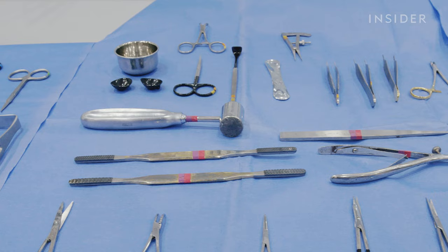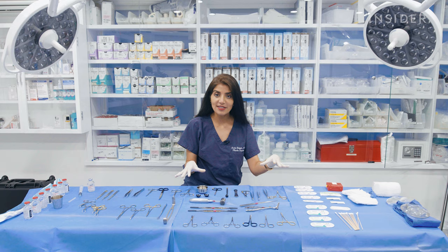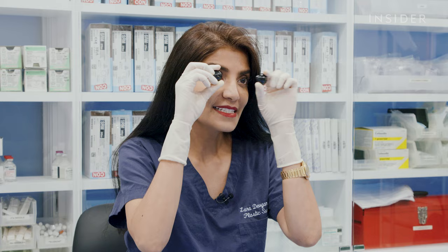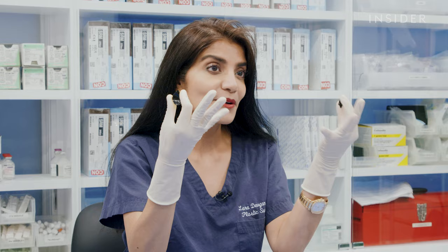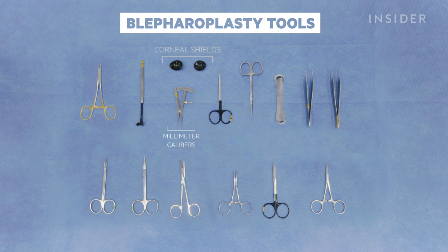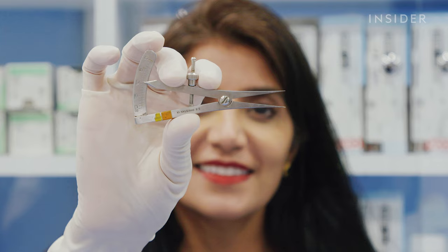These fine and beautiful instruments here in front are some of the instruments that I use for blepharoplasty. First, I use corneal shields to protect someone's eyes so that we don't get corneal scratches or irritation when we're doing the surgery. Next, I use these millimeter calipers to precisely measure the fine details of the operation, because you want to make sure that not only is the lid margin length the same on both sides, but that one eye is exactly the same as the contralateral eye. So the calipers are an elegant take on a millimeter ruler that is sterile and prepared for the surgical field.